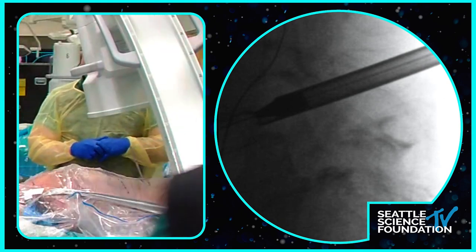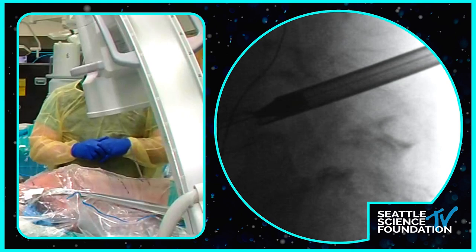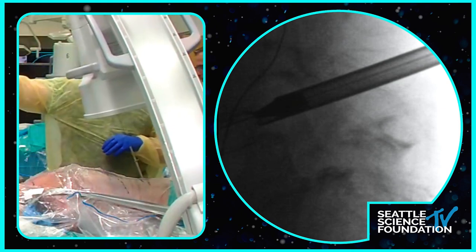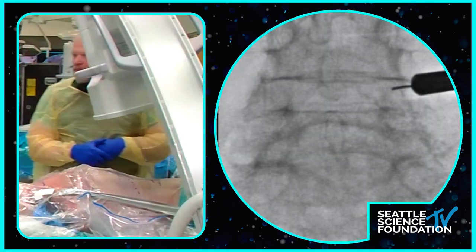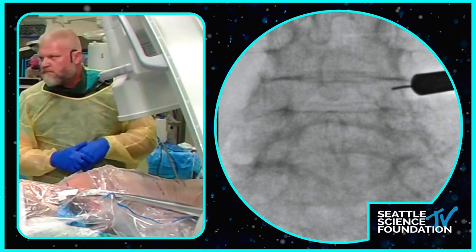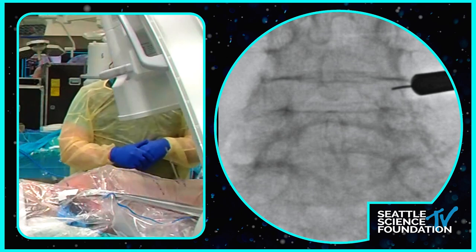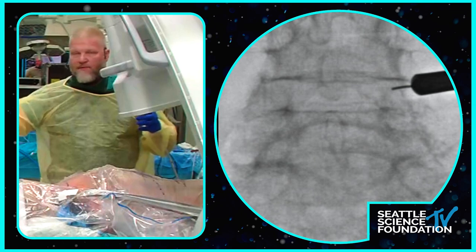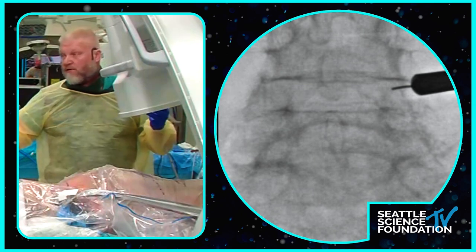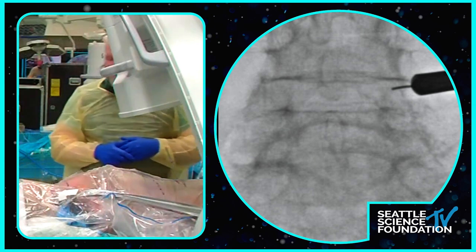Yeah, and to build in that extra centimeter or two, you could just measure to the front of the disc instead of the middle of the disc. That's more lateral than I want to be, but in the situation of foraminal stenosis, that may be as far as you can get, like at L5-S1, for instance, if the crest is in the way.